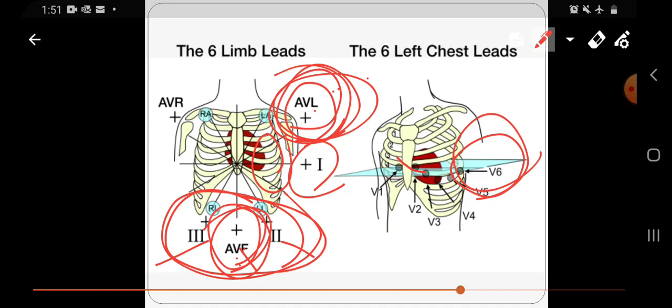Okay, so in case of myocardial infarction, the earliest signs are ST segment changes. Later on these ST segment changes will reverse. The ST segment usually returns to baseline after a day or 2, so these are not permanent changes. But there are other signs that may happen later on, which are T-wave inversion and development of pathological Q waves. Okay, and usually these changes, especially the pathological Q waves, are permanent changes.